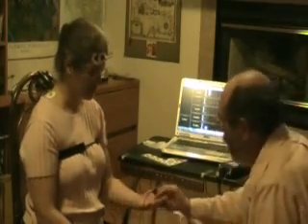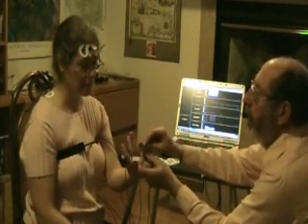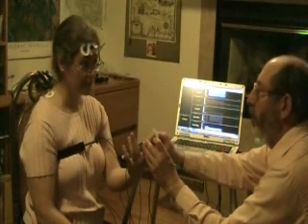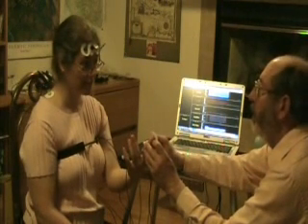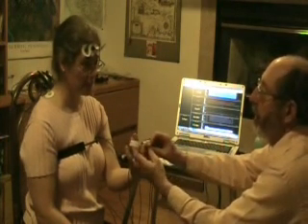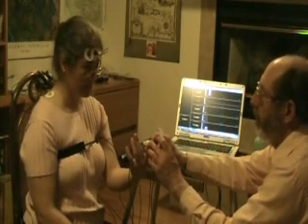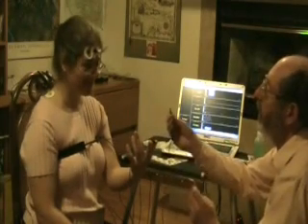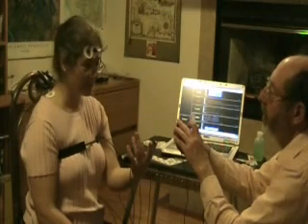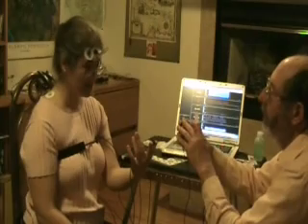Okay, the next thing we're going to do is record blood flow. All of the heat that comes out of your extremities is caused by blood flowing within about 1.5 centimeters of the surface. So this whole thing isn't 1 centimeter deep, so we can pick up all the blood flow by picking up the temperature coming out. This little device is called a thermistor. It's a chemical that's sensitive to temperature. It changes electrical resistance as temperature changes.